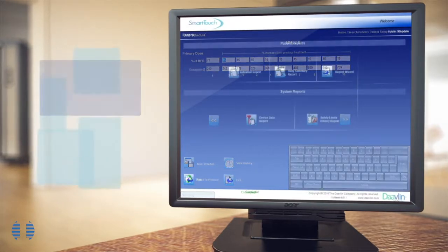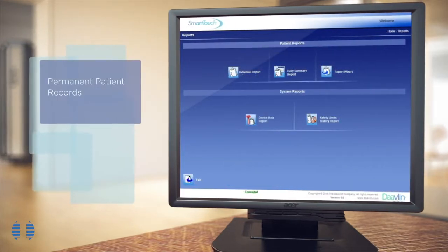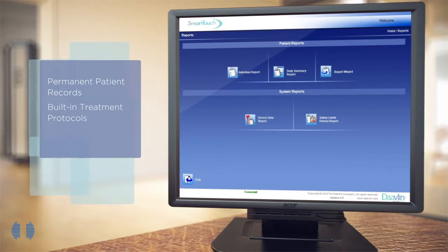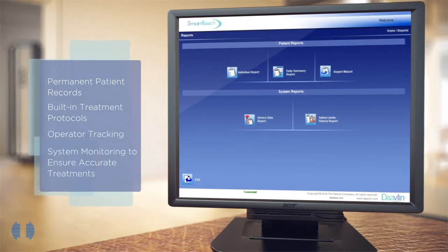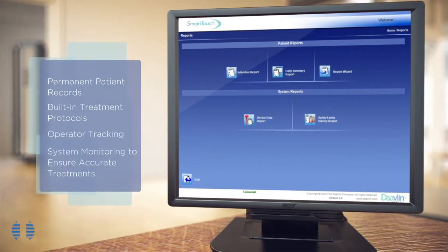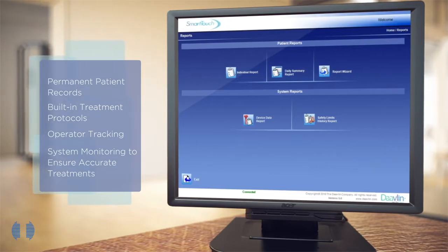Features of Smart Touch include permanent patient records, built-in protocols, operator tracking, and system monitoring that ensure the accuracy of treatment settings and prevent errors.